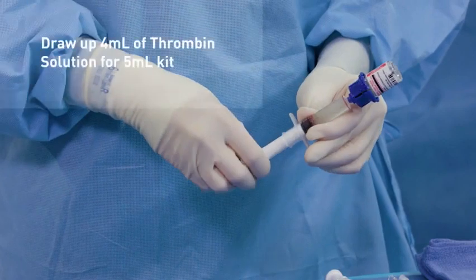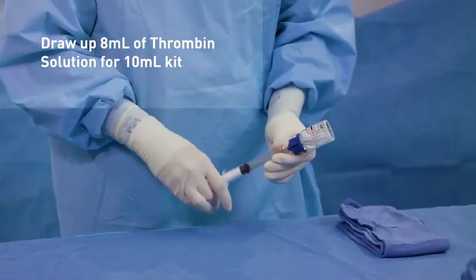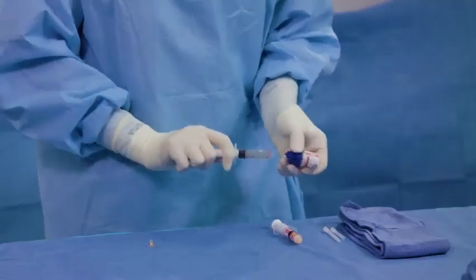Draw up to 4 milliliters of thrombin solution for the Flow Seal Matrix 5 milliliter kit, or draw up 8 milliliters for the Flow Seal Matrix 10 milliliter kit. Remove the syringe from the vial adapter.